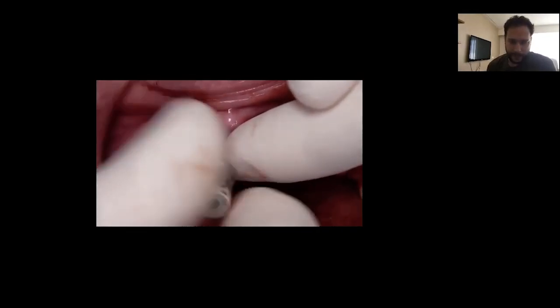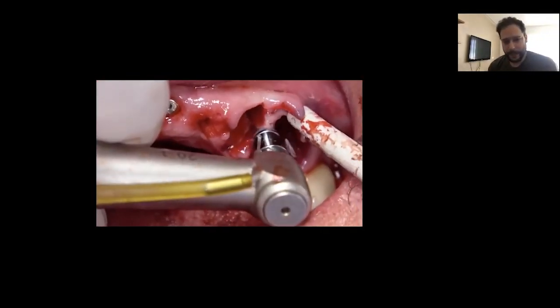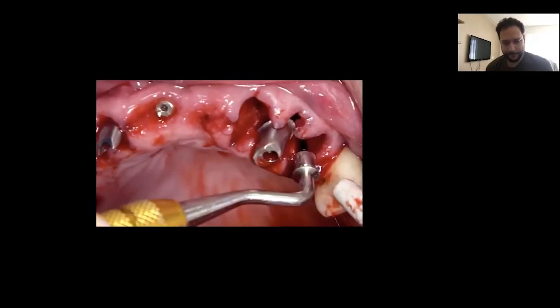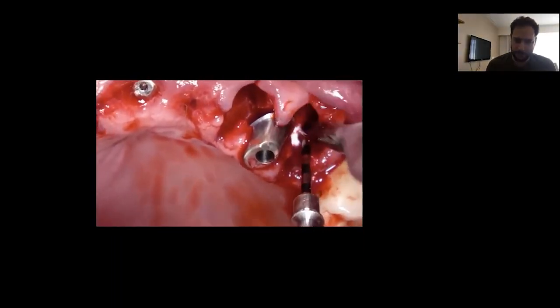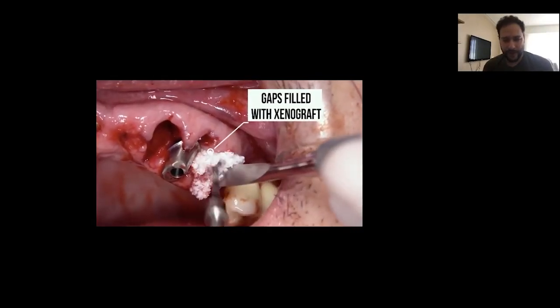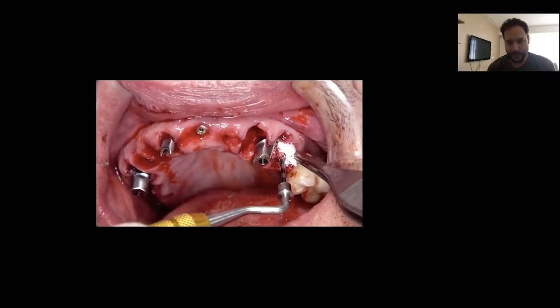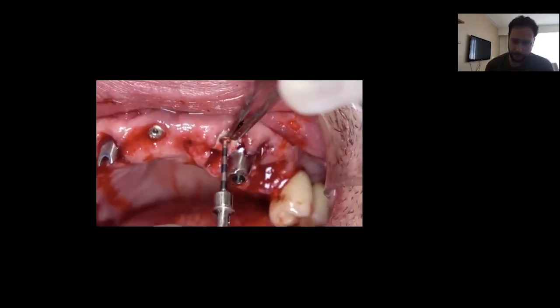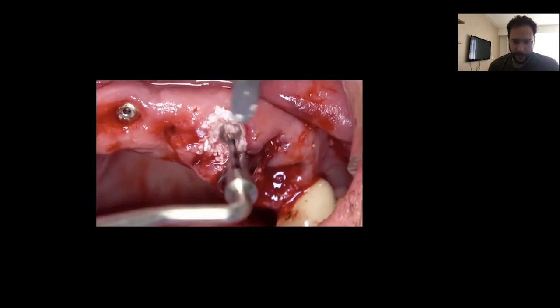After achieving the correct orientation at all sites, we seat the customized provisionals in place. We must check our provisionals each time we connect a customized abutment, one by one. We then fill all the sockets — all the gaps from the large infections present in these sockets — filling all the bone deficiencies created by the infections with xenograft.